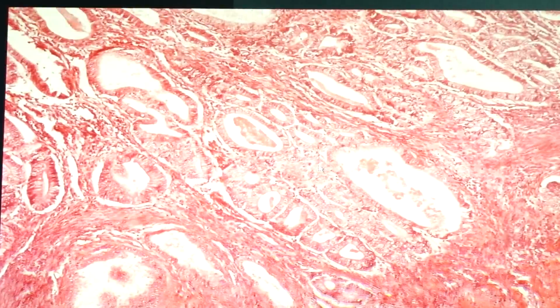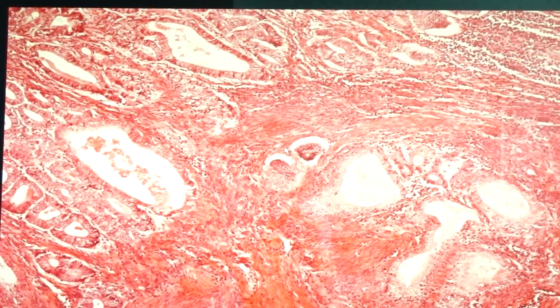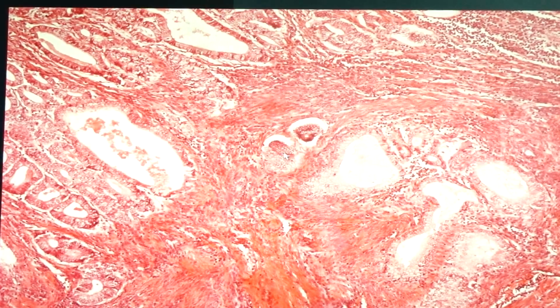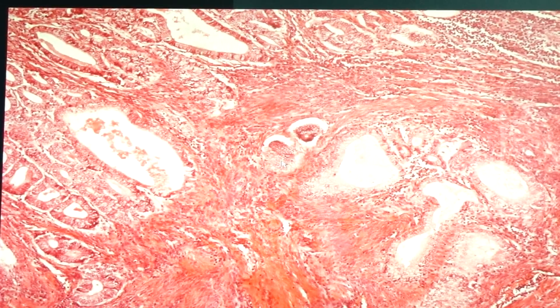So what is well differentiated? That's grade 1, if the majority of the atypical cells are forming glands. So this is the well differentiated or grade 1. If you see atypical cells forming nests, which is not present here, for example, like this one, then you call it grade 2 if there's 50% or less of those nests.